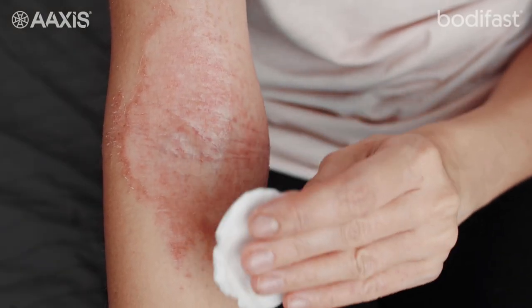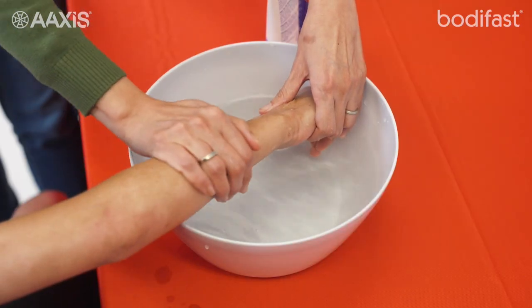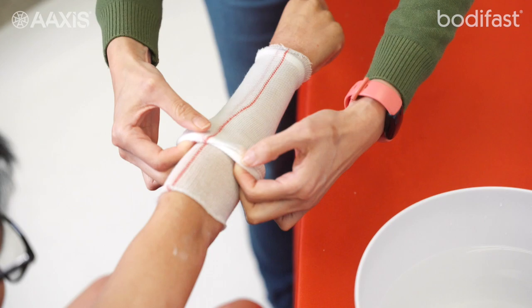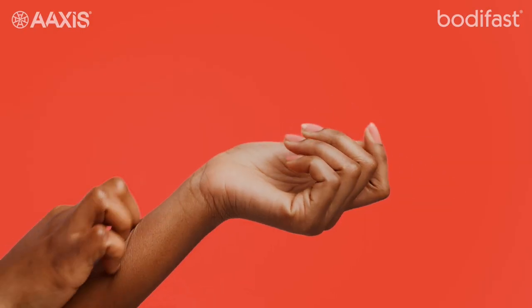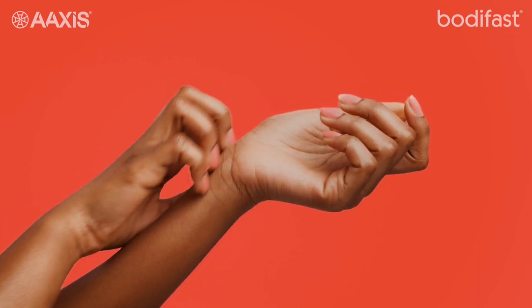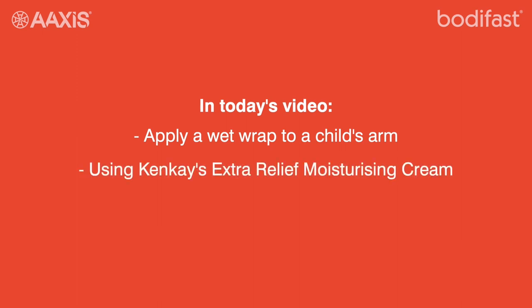Wet wrapping is a very effective treatment for eczema flare-ups. By cooling the affected area, locking in moisture and reducing scratching, wet wrapping can provide relief from the painful, burning and itching eczema can cause. Today we will demonstrate how to apply a wet wrap to a child's arm that is affected by eczema, using Kenkay's Extra Relief Moisturiser and a Bodifast tubular bandage.